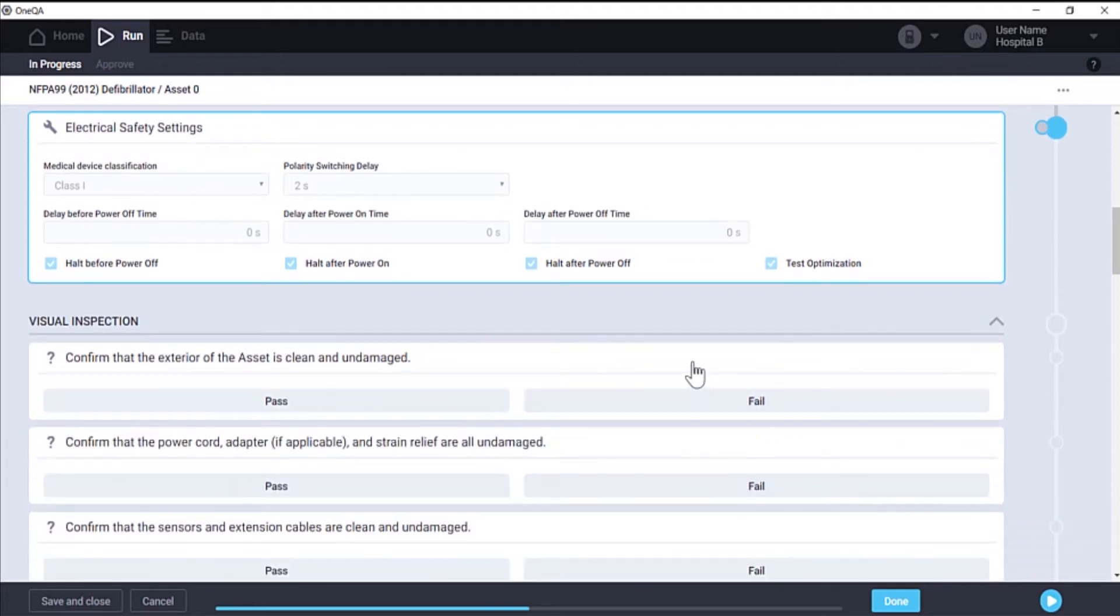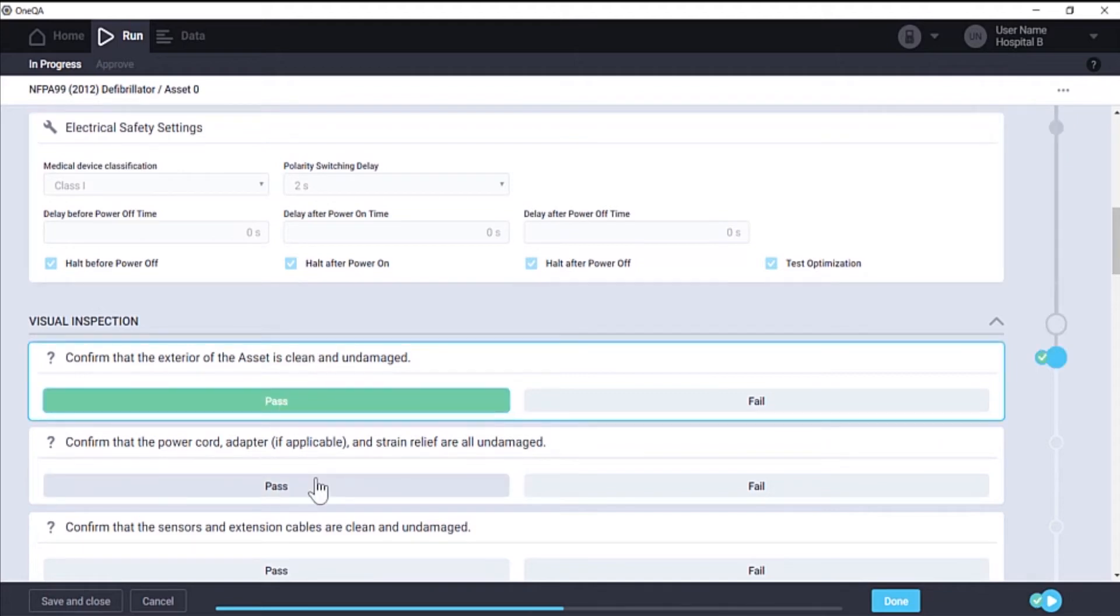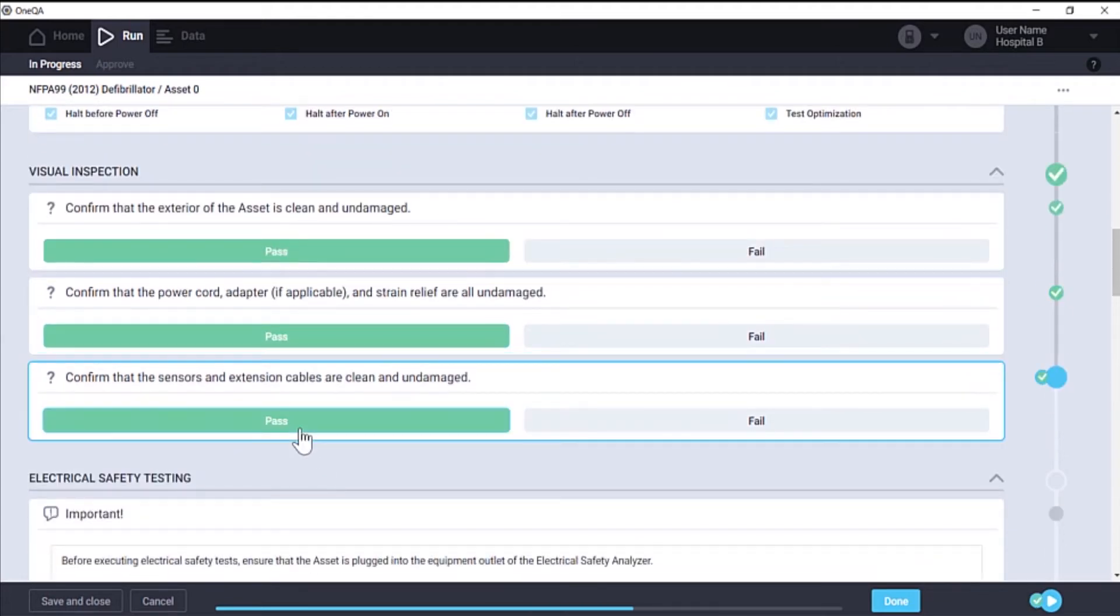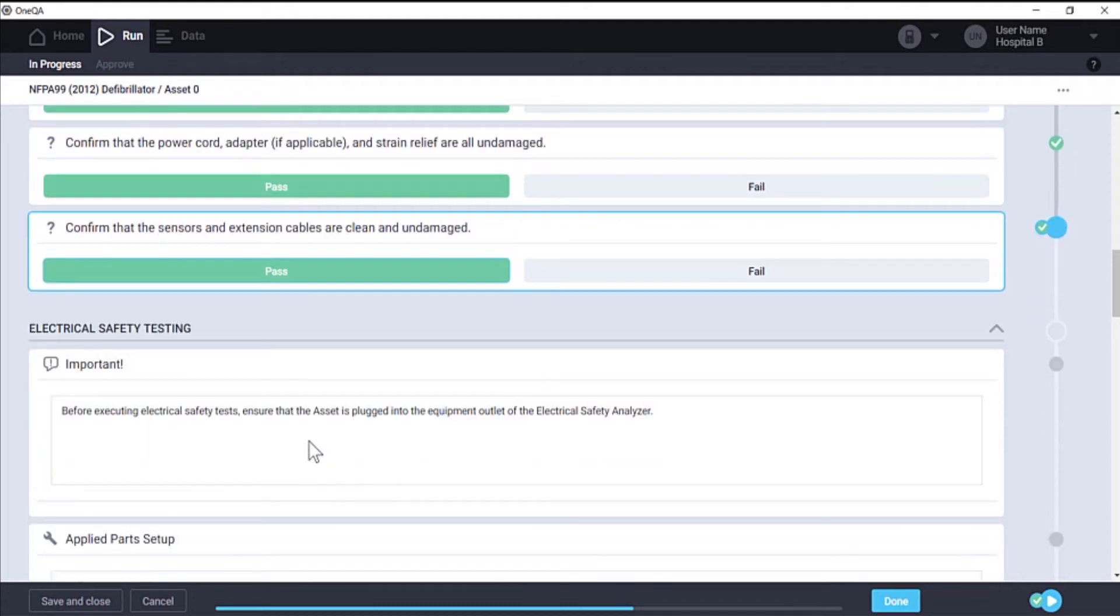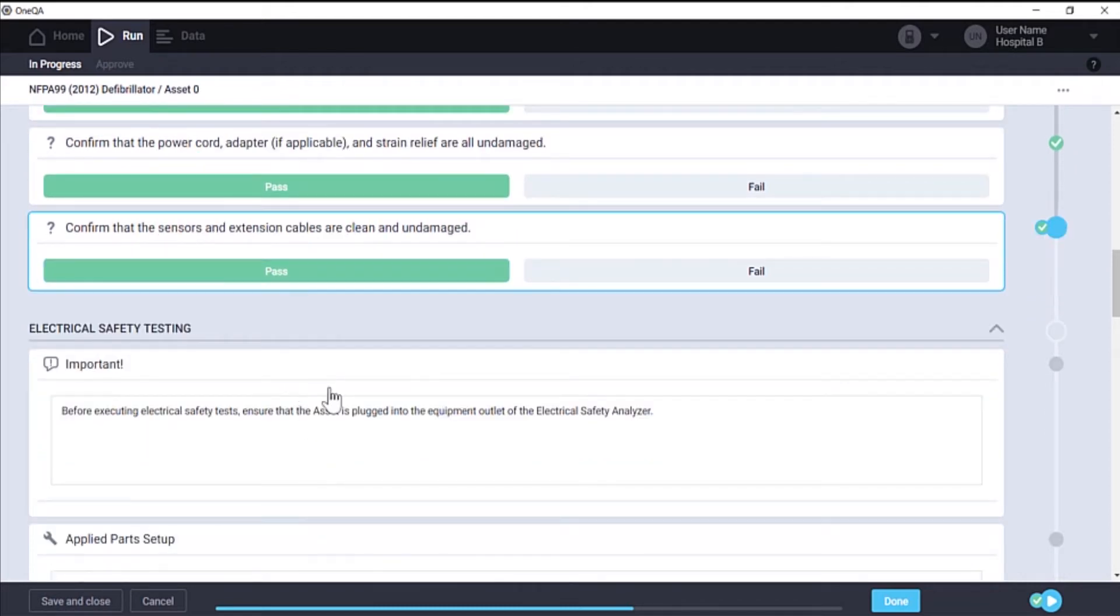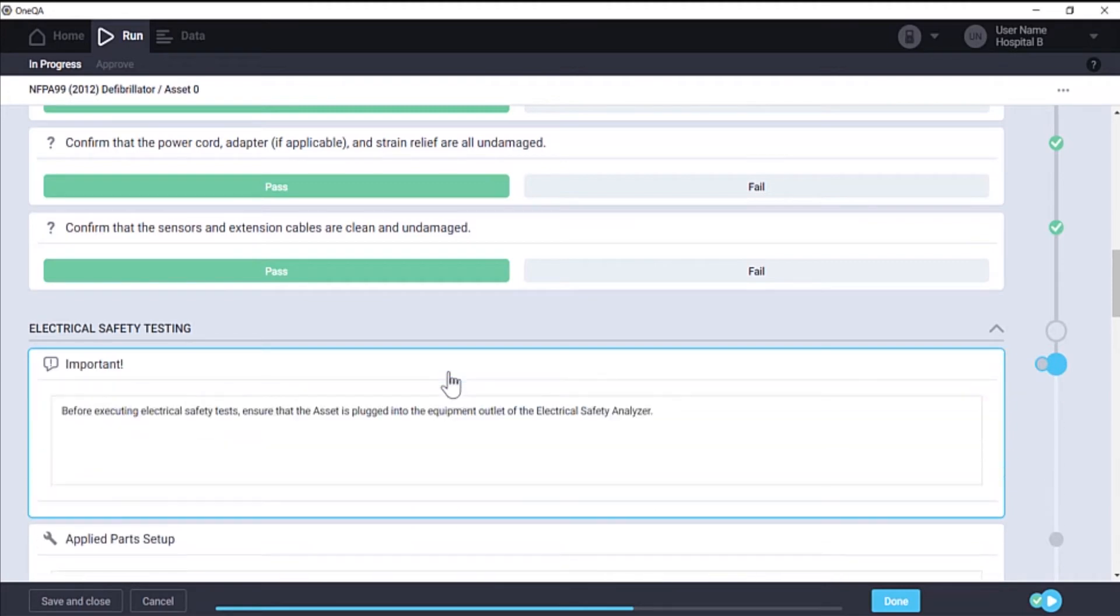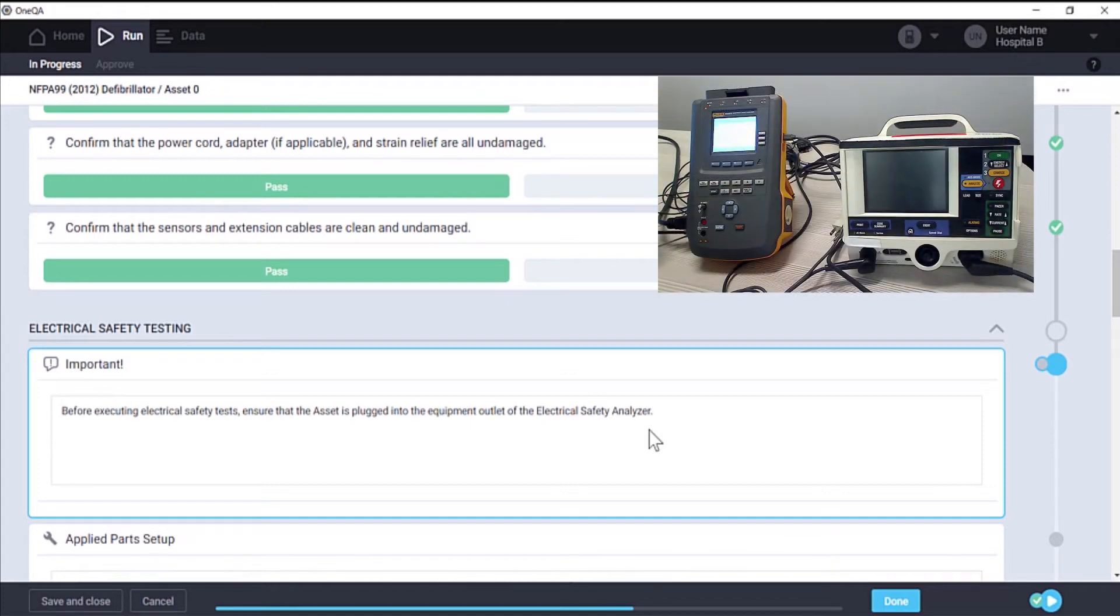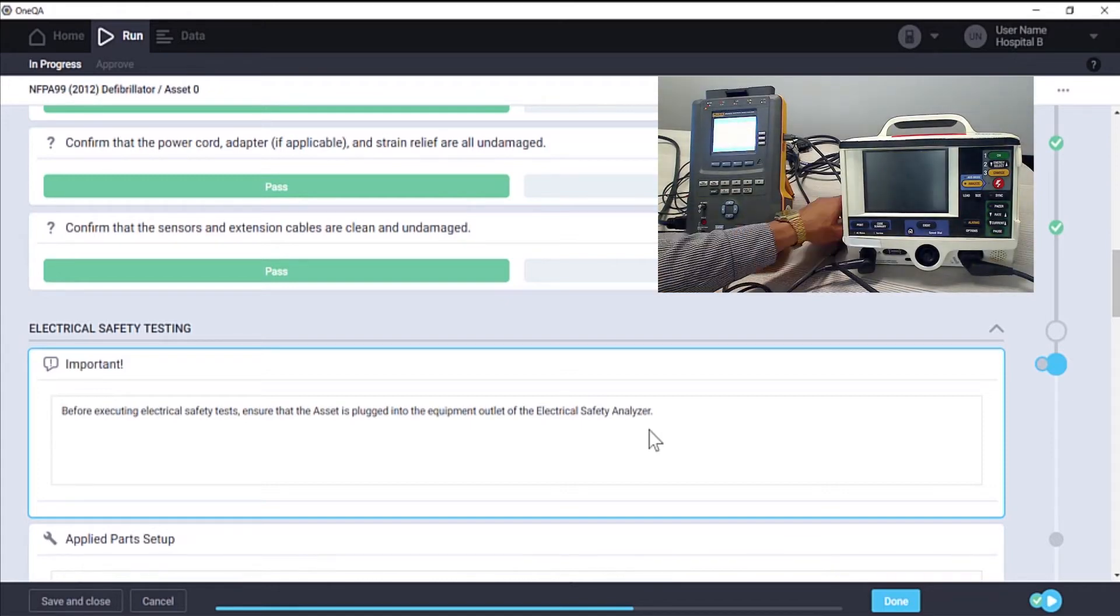The first section in this procedure is for visual inspection. The next section is for electrical safety tests, which begins with a reminder to plug in your asset to the equipment outlet port of your ESA.